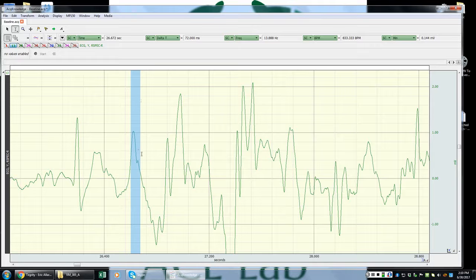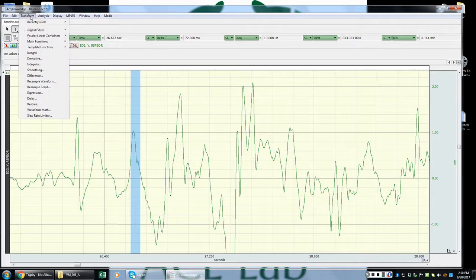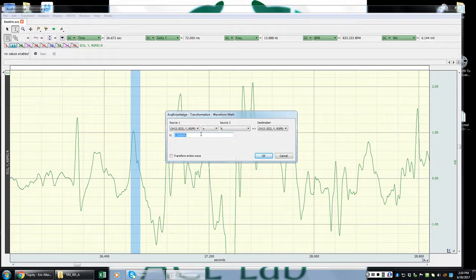The way that we move peaks here is through what's referred to as a transformation procedure. You go to the Transform menu at the top and choose what's referred to as Waveform Math. That is basically a mathematical adjustment to the actual waveform. So click on that. It's asking me what source I want, channel 13, this is what I have, and then what mathematical operation we can do. We can add, subtract, multiply, divide, or use exponents, and then a source, which is basically just a constant, to put on this wave.